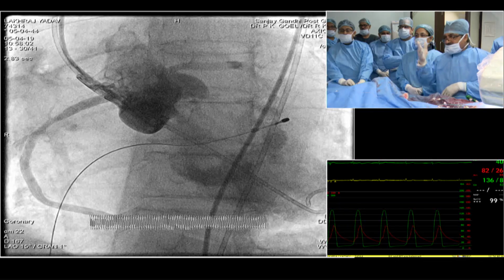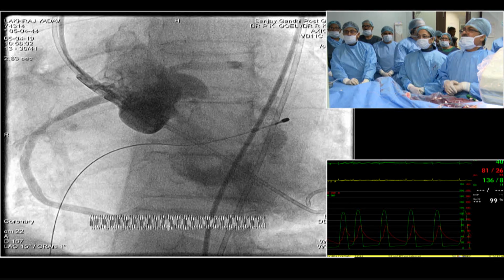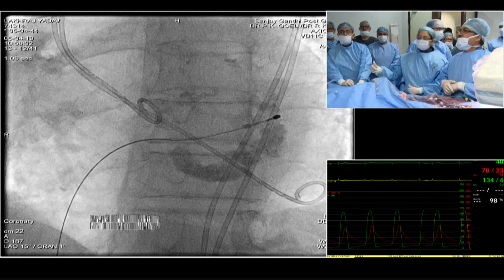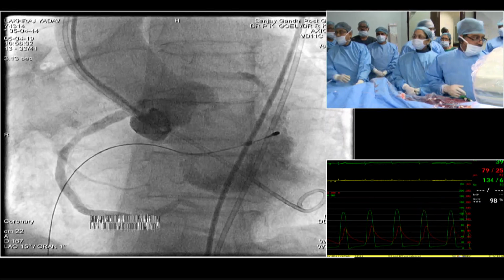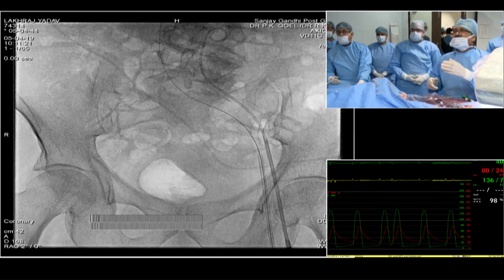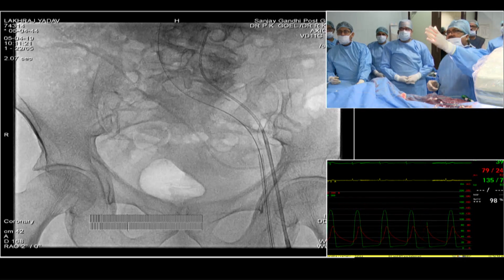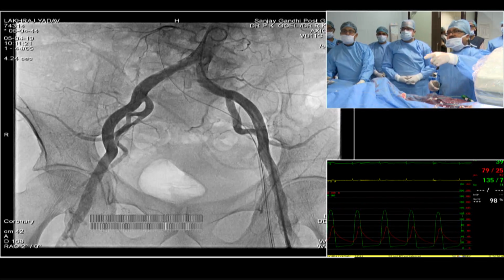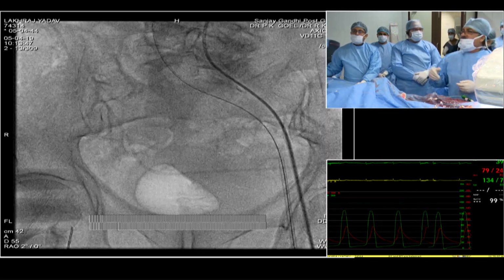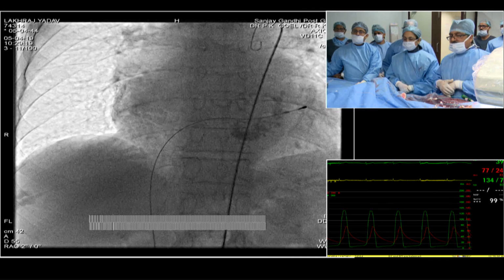So I'll just show you now the current pictures where we are. Next, can I see the live angios, please? The ones that we have just done. Can we have some fluid in? So that's the angio at the bottom. That's the peripheral angio. The division was low, so we could puncture reasonably okay. Next, please.